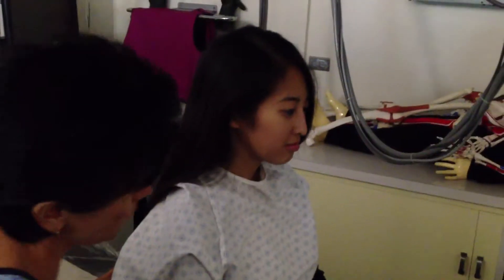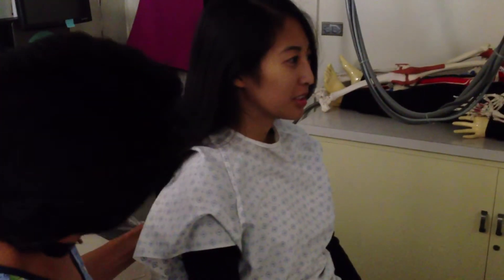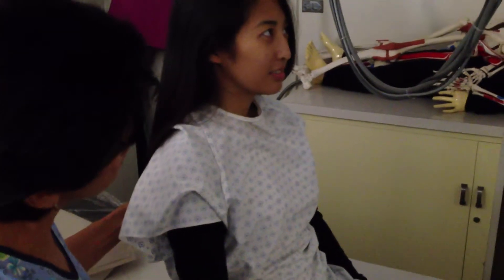Put a cassette. I'm going to bring the tube out. I'm going to put maybe a 10-degree caudal angle. Bring your chin up for me, Catherine. Bring your arms out like this. Shield.